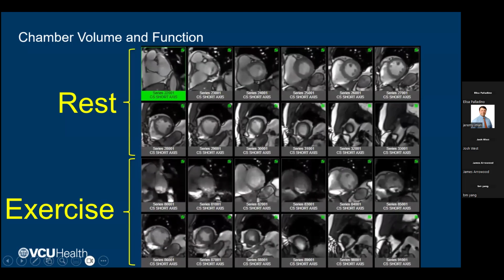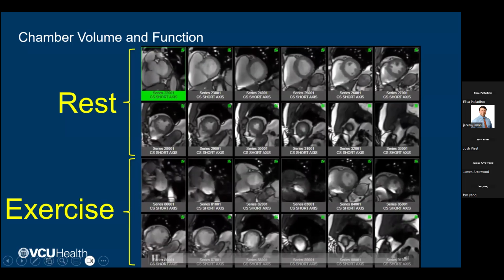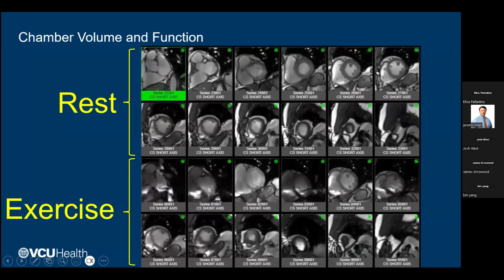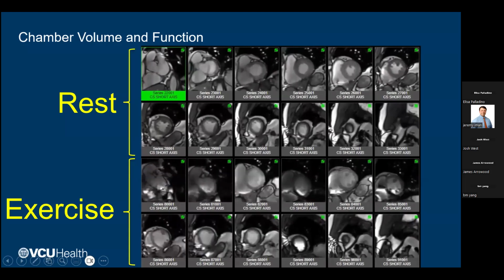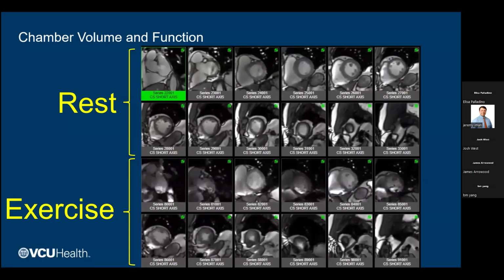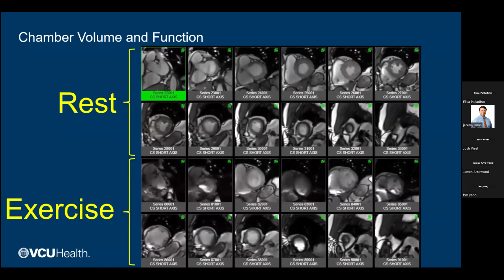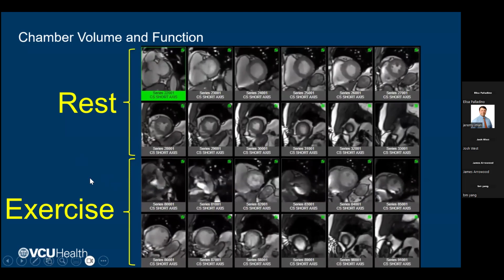So there's a decent amount of image artifact, but if you slow this down and just go slice by slice, what I tend to find is that for all its shortcomings and little bits of image artifact, compared to the stress echocardiography laboratory, the visualization is still quite good and superior to echo. And within the base of the LV, you usually get about 3 slices, so you get a few different cracks at it, even if one slice offset is not the best. And you can contour it to look at things like augmentation of LV stroke volume, which is something that we do in a lot of our research studies.